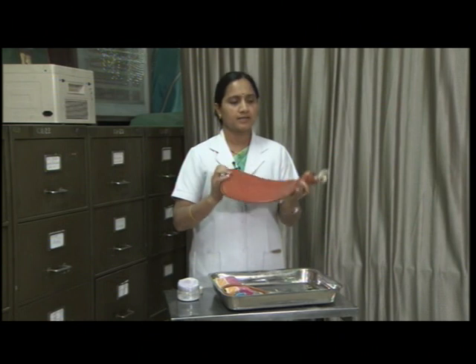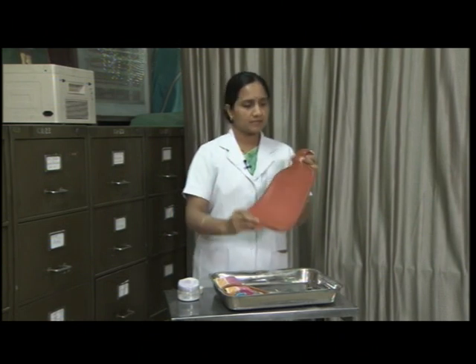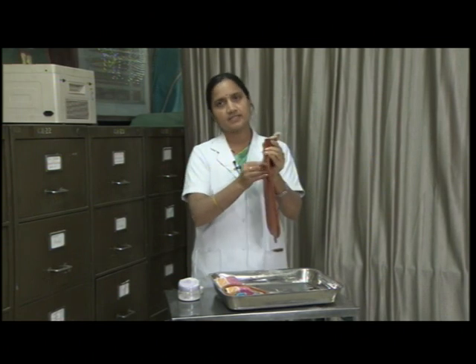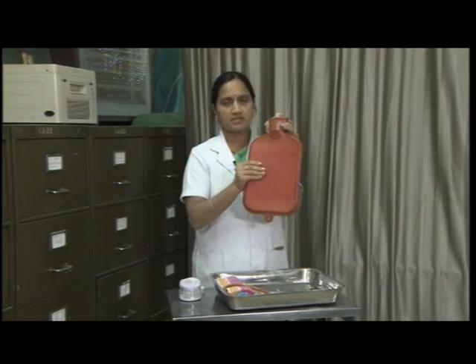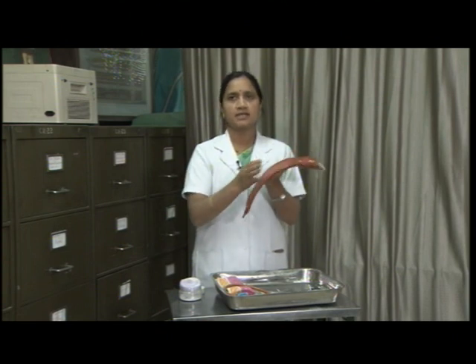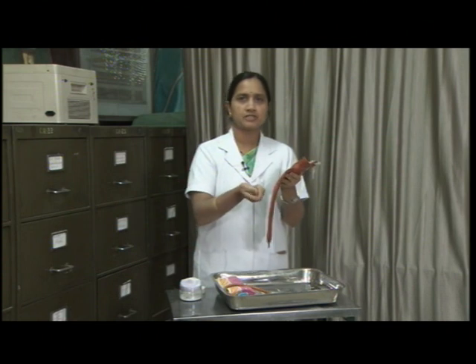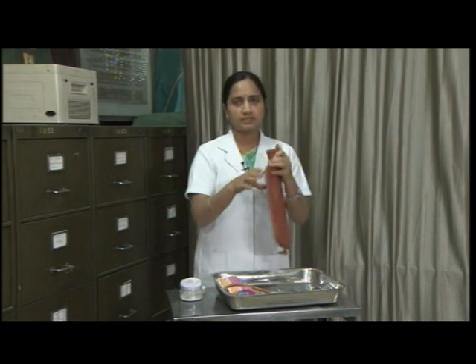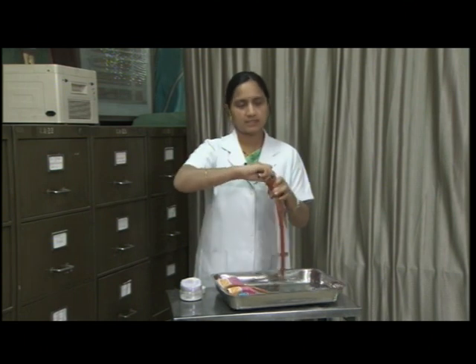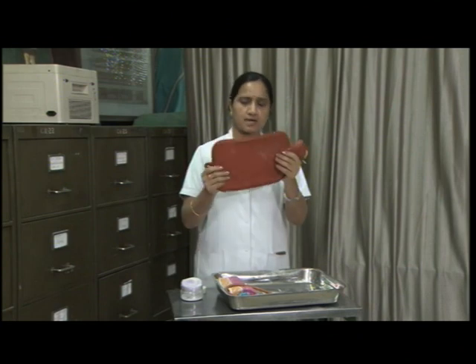For the hot water bag, I have washed this hot water bag and after drying it, I have just inflated air into this bag so that the two surfaces do not adhere to each other. If they adhere, there is a chance of deterioration of the water bag. So I have inflated the water bag and now, closing it with the cap, I am storing it in a dark place.